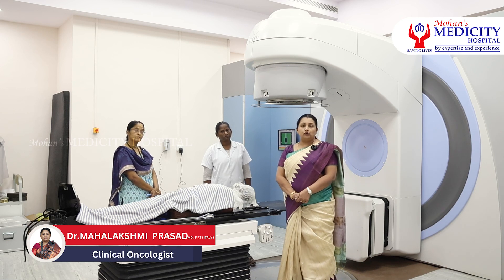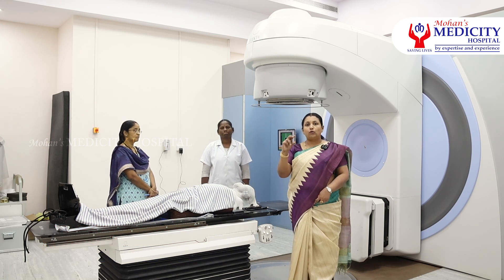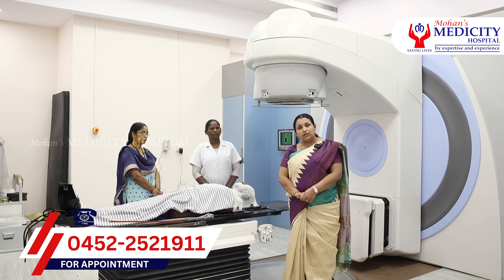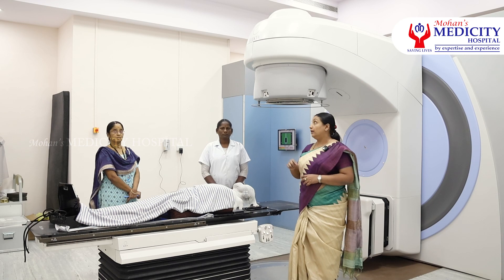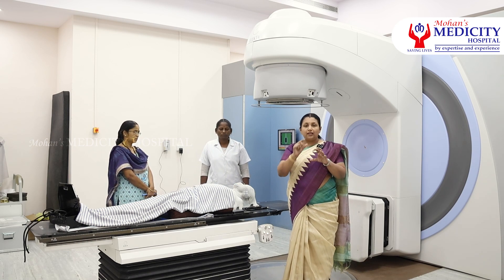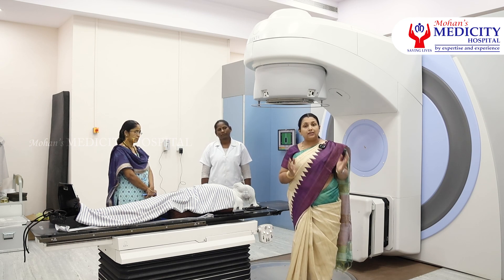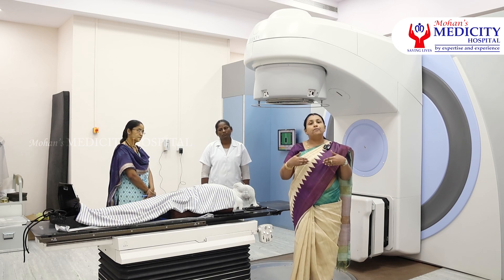We can use CT images. When we treat with CT images, we can localize the area and define high precision radiation. An advantage of this machine is that there are 40 pairs of lead leaves. Using CT images, we can define the area of the tumor and deliver radiation precisely to the tumor while sparing normal tissues.